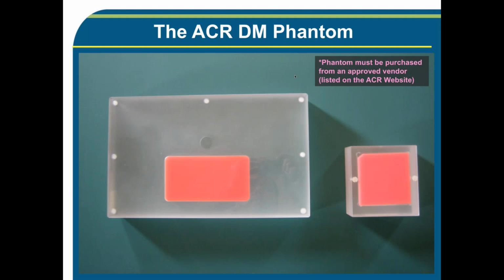So if you have artifacts, they'll jump out at you pretty quickly, and you can see the whole detector. No longer do you just see where the wax insert is on the small detector. So this is one of the primary advantages of this Phantom. What you can't see is that it's almost the identical thickness as the old Phantom, but you can see the wax insert and there's a cover plate. So it's almost the same thickness, but larger.